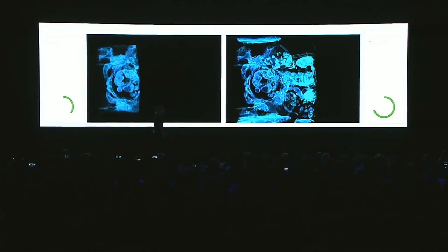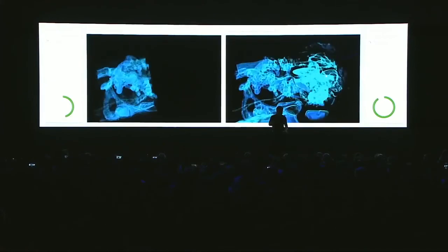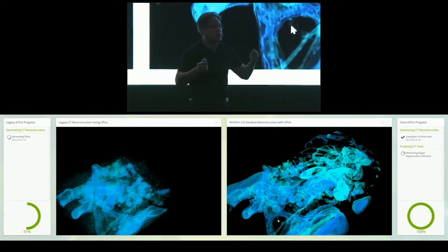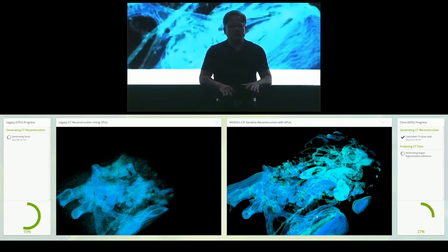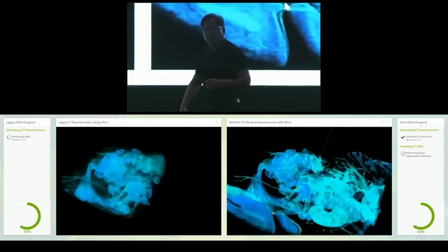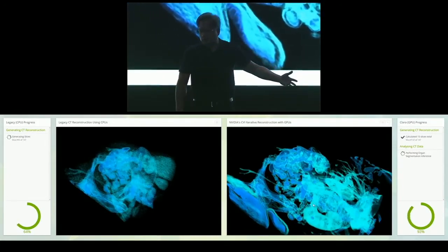The other way to think about that is this. If this is the level of fidelity that you're comfortable with, you could reduce the amount of energy dose by a factor of 6. Another way of saying it is this. We can now use CTs for even children. Today, you can't use CT for children because the X-ray dose is too high. So the opportunity to be able to use medical instruments with computational advances is really quite groundbreaking. That's why GE calls this particular machine with IRT Revolution.